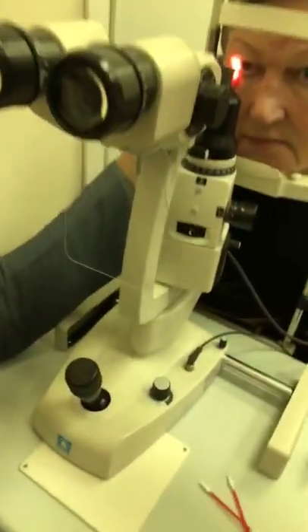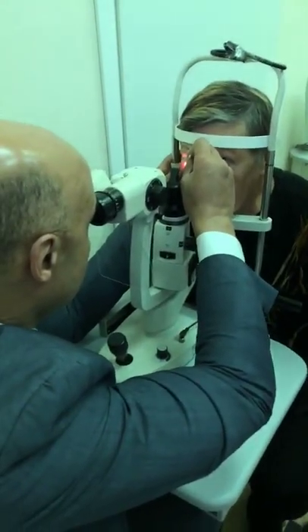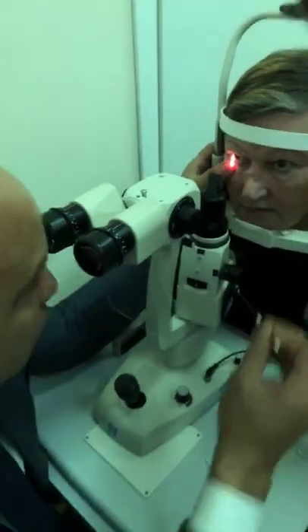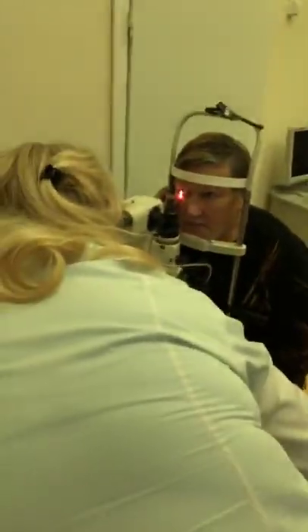You want to go ahead and look? It's not going to be on video, it's too bright. But if you want to look through, you see the stuff that's coming out. After one procedure. Do you guys want to see the stuff that's coming out of her glands? You see that? So she's got toothpaste coming out of her glands.